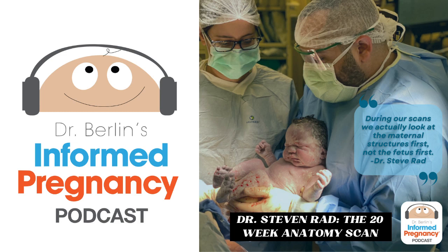And then around the bladder, we talked about how you tell a 3-vessel umbilical cord. You look at the 2 umbilical arteries which pass over the bladder before they go into the belly button, which, by the way, we look at the umbilical cord insertion in the abdomen as well. We talked about the abdominal cord insertion, the placenta. We also make sure that the umbilical cord is coming out, that the abdominal wall is closed. There's abnormalities where there can be an opening in the abdominal wall and the umbilical cord itself, and the organs of the abdomen are just sticking out or spilling out.